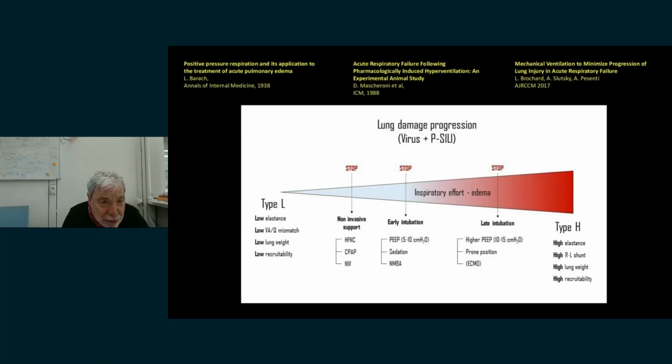I change the motor, I change the way I provide energy, but the big tidal volume is obliged in this patient, who has a tremendous respiratory drive. And of course, nobody measured it. The people were looking. And who was measuring the tidal volume, the stress, the strain in a spontaneous breathing patient?